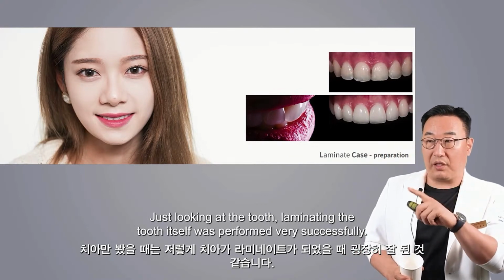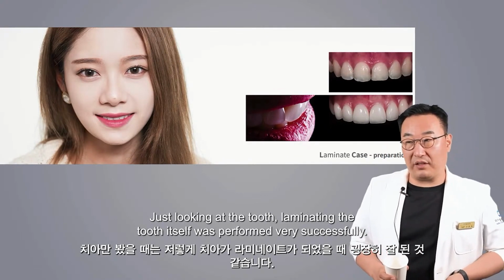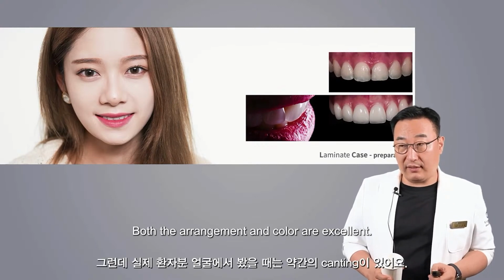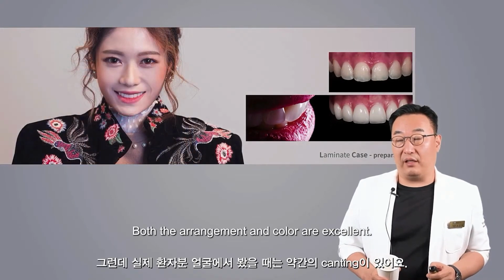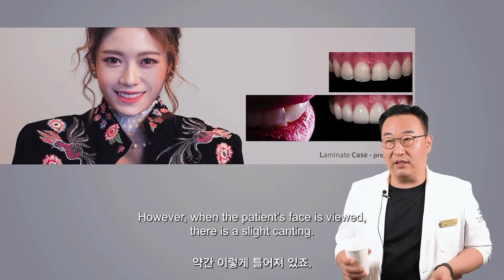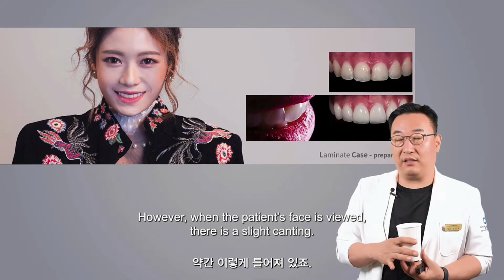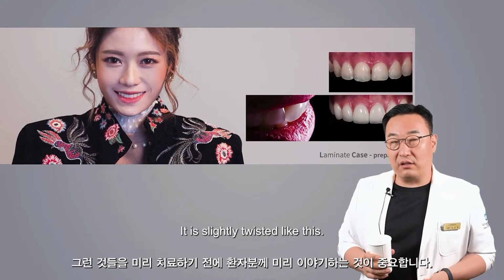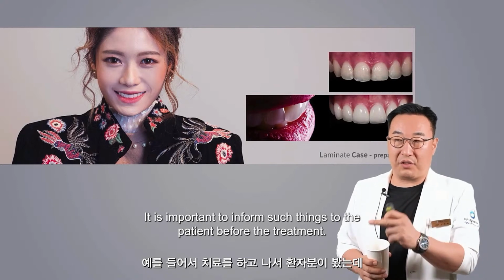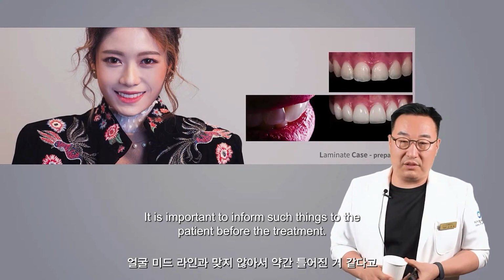Just looking at the tooth, laminating the tooth itself was performed very successfully. Both the arrangement and color are excellent. However, when the patient's face is viewed, there is a slight canting. It is slightly twisted, like this. It is important to inform such things to the patient before the treatment.